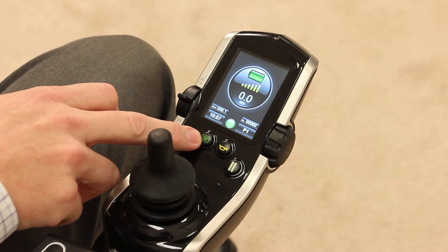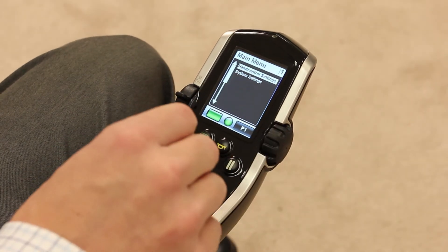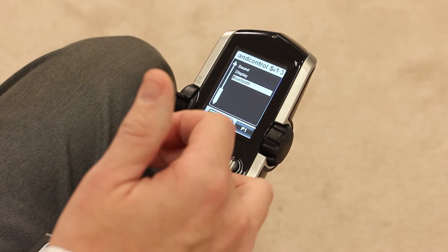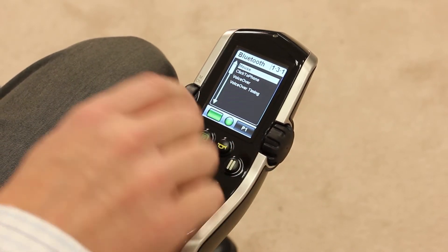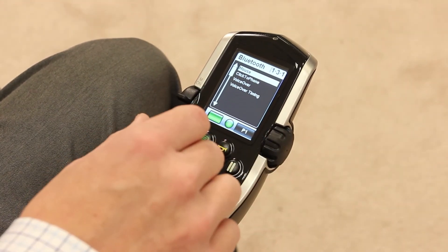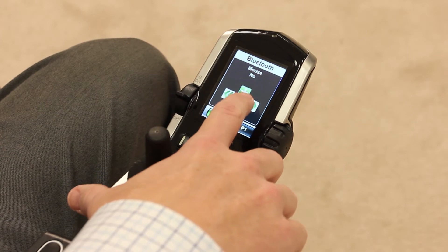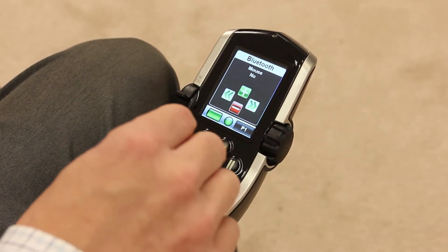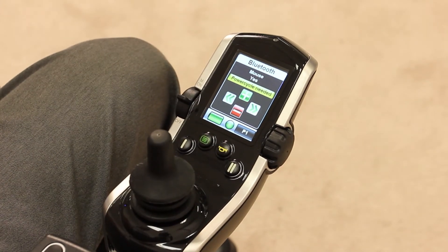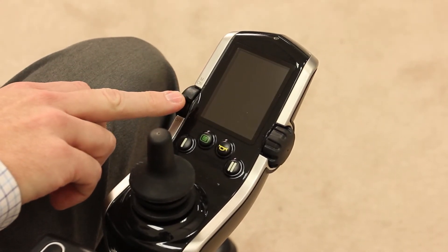The first thing we have to do is click the green menu button. We're going to go to hand control settings and give a right joystick command. We're going to go down to Bluetooth and give a right joystick command. We're going to turn on the mouse function because we're going to link this up to a Windows-based tablet. Right now it says mouse no — we have to push the joystick forward to turn the mouse on. You'll see that a power cycle is needed, so we're going to shut the chair off and turn it back on.